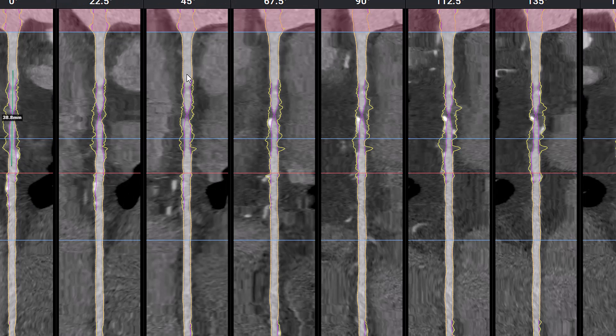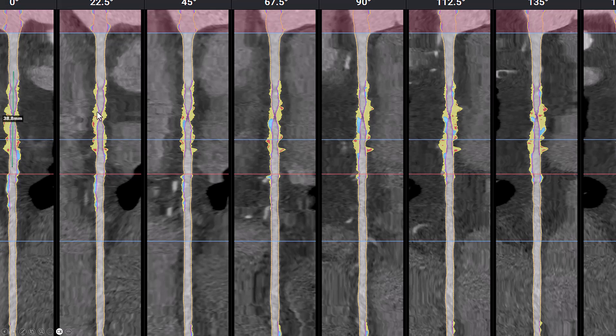These are the linear MPRs, and there is a lot of plaque. There is only a limited amount of calcium on the right coronary artery.